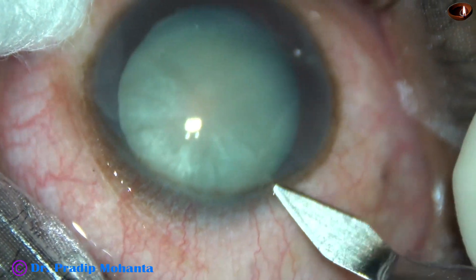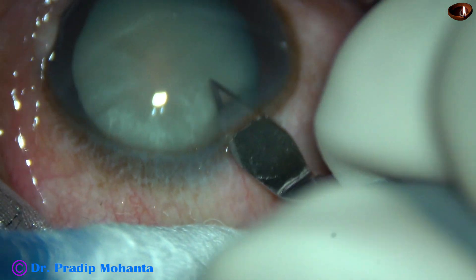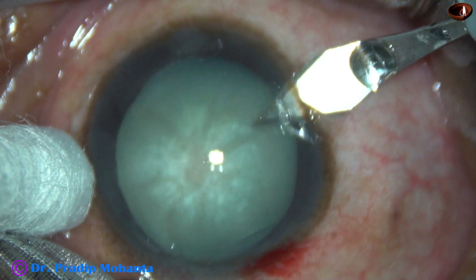The main incision is placed on the posterior aspect of the limbus at around 11 o'clock. A side port is made at around 8 o'clock with the keratome itself.